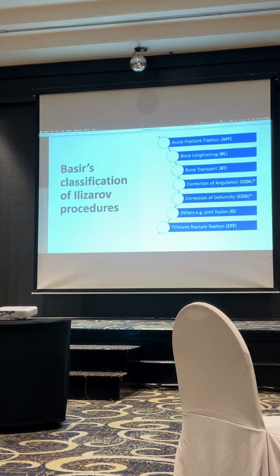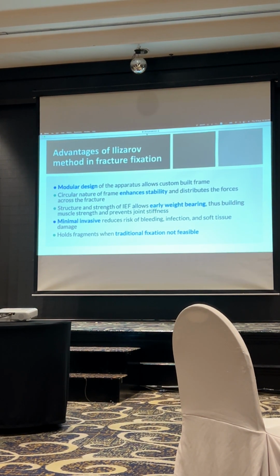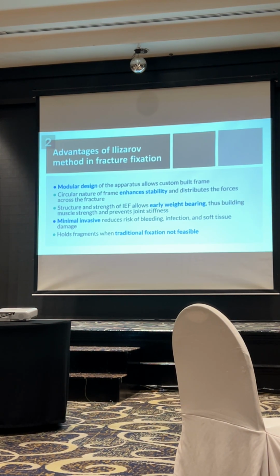So next. So the advantage, before we go into the indication, like what was explained by other professors before, it is a modular design. So it is like Lego. We fix on various patterns of fractures. So it has the circular nature of the frame, enhanced stability, and with Ilizarov you can allow the patient to early weight bear.